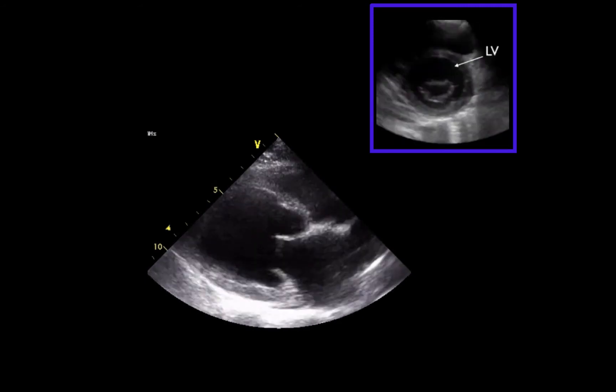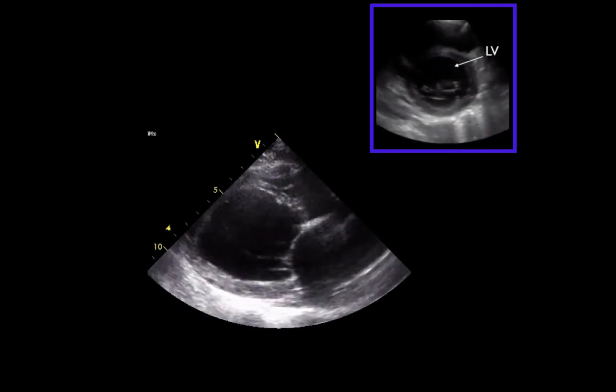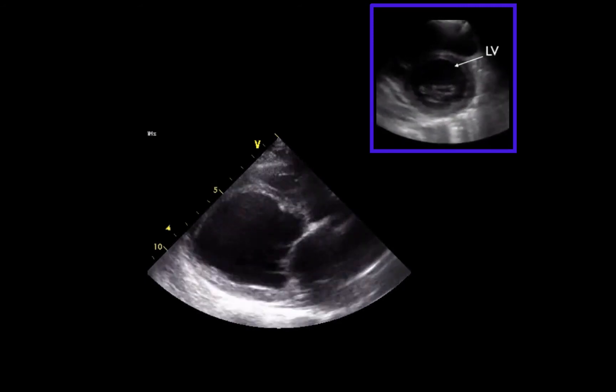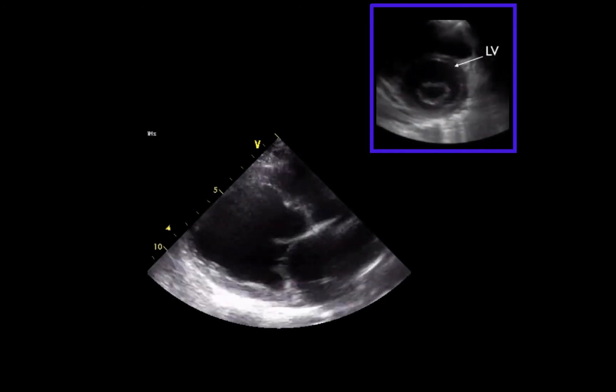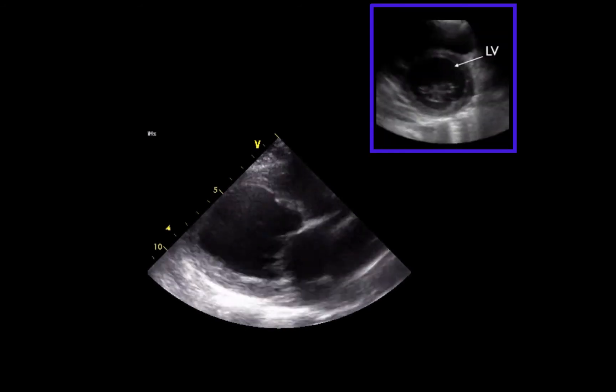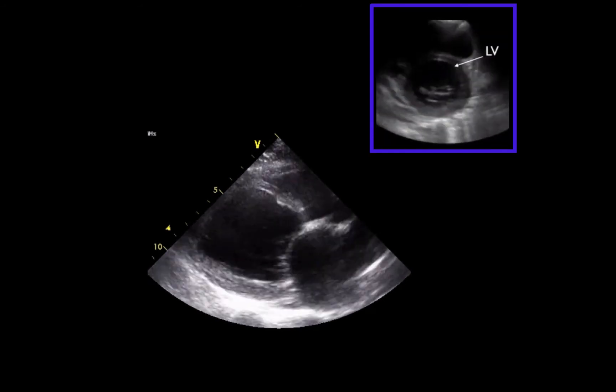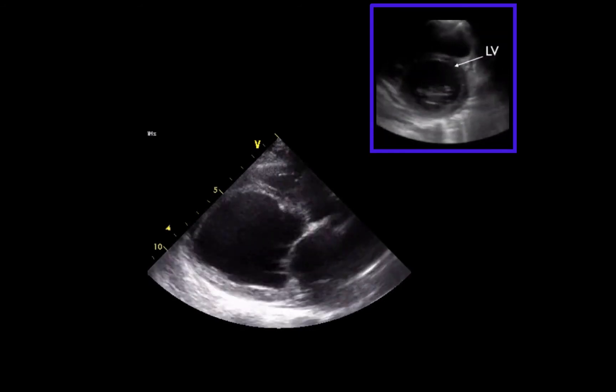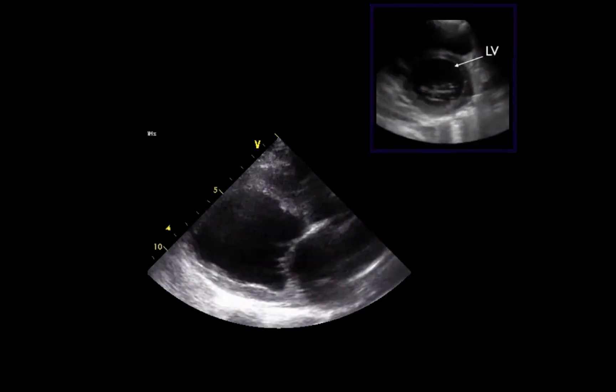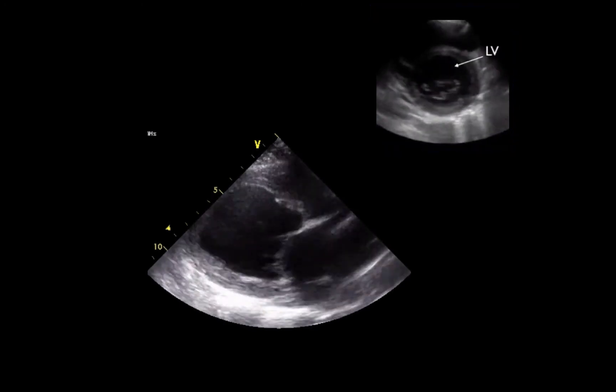On the right parasternal short axis view, you can appreciate very similar findings: poor endocardial excursion and a lack of wall thickening during systole.